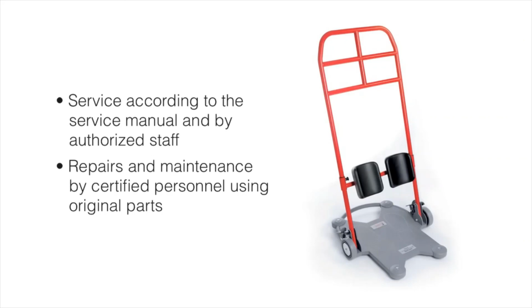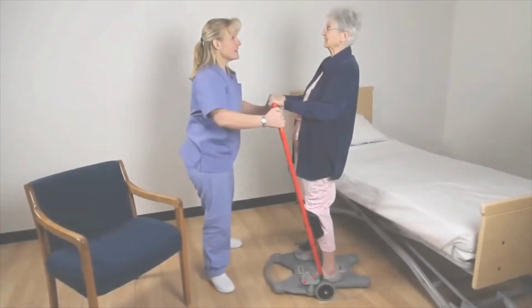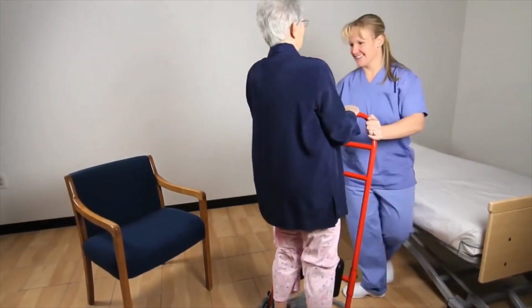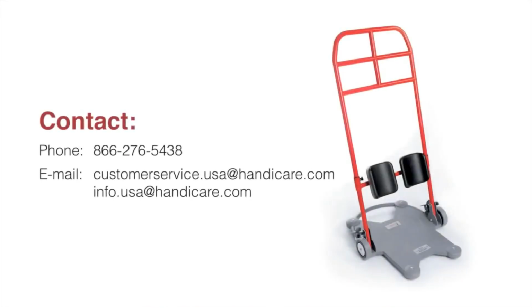When storing, keep the return at a temperature above freezing and at a relative humidity of no more than 60%. Taking the time to remember these simple procedures will pay off in years of safe and comfortable lifting for you and those you care for. If you have any questions or comments, please consult your local distributor or System Romedic specialist.